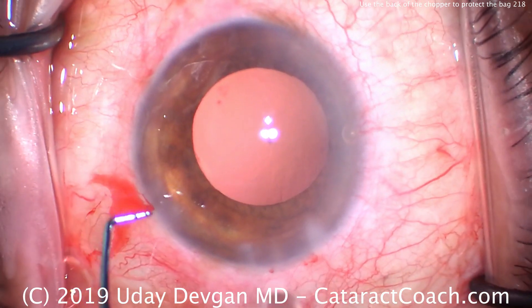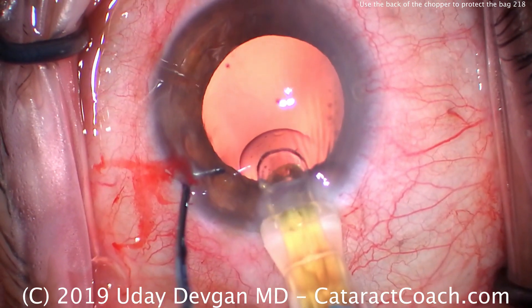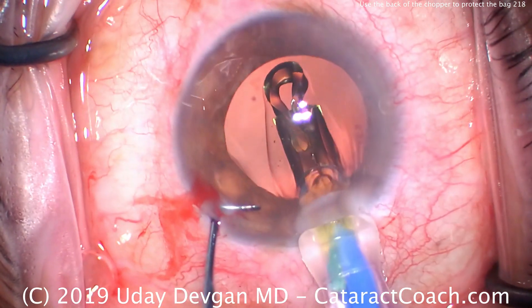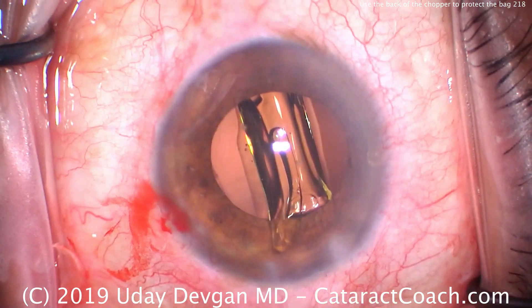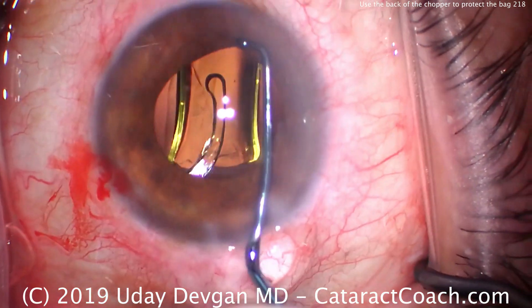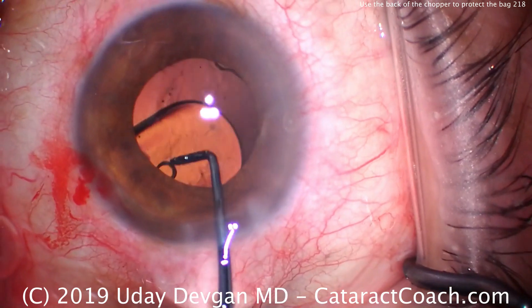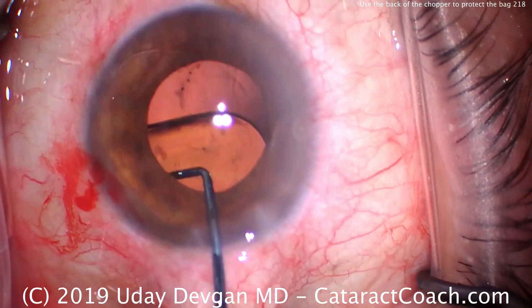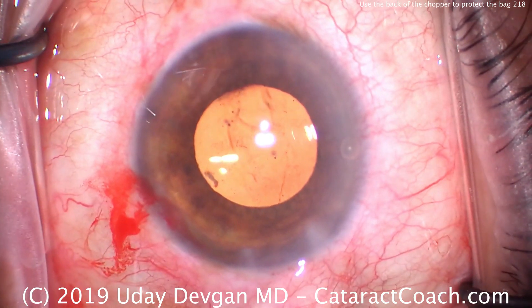We're now going to place our IOL in the capsular bag — a single-piece acrylic lens — and put it right there inside the eye, underneath the nasal rexus, and advance it. We'll use our chopper to carefully go in and dial the entire lens into the capsular bag, and we'll ensure that both haptics open. You can tell how small the eye is — that's a 6mm optic, and it looks positively huge inside this eye.